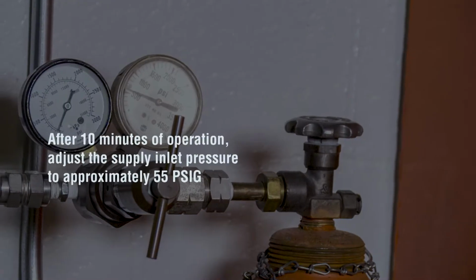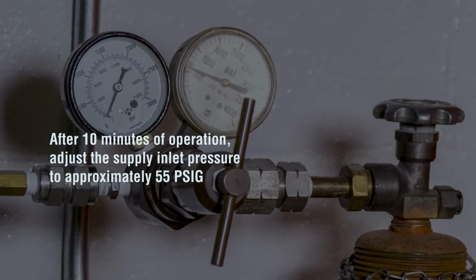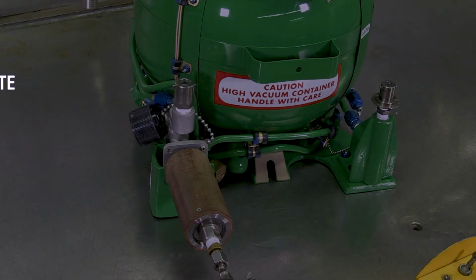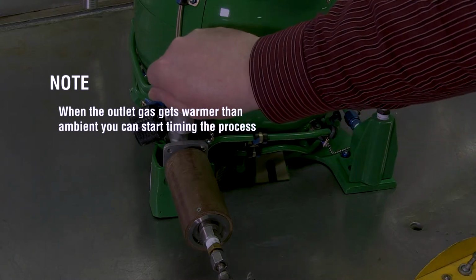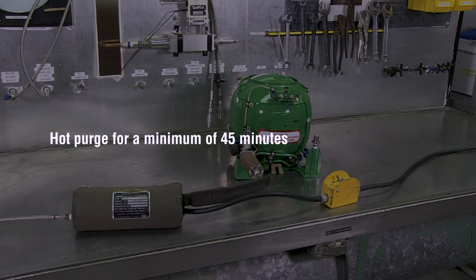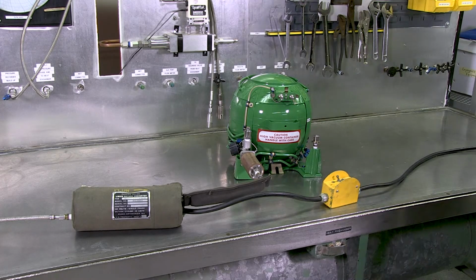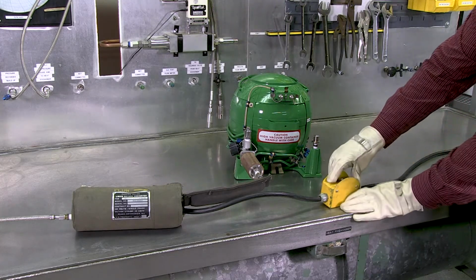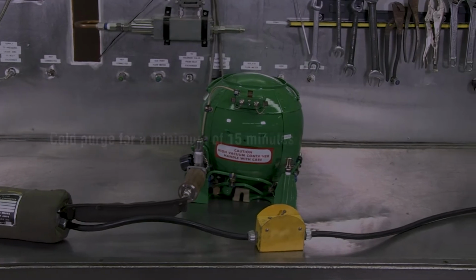After 10 minutes of operation, adjust the supply inlet pressure to approximately 55 PSIG. Note: when the outlet gas gets warmer than ambient, you can start timing the process. Continue to hot purge for a minimum of 45 minutes while the exhaust temperature is above ambient temperature. After completion of hot purging, turn the purge heater off and cold purge for a minimum of 15 minutes or until components have returned to ambient temperature.